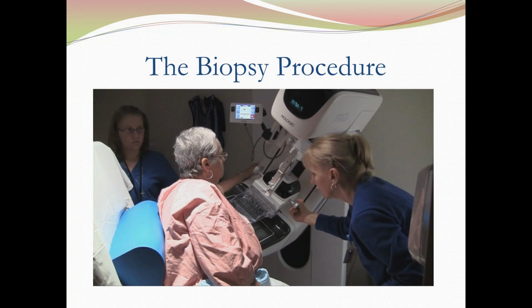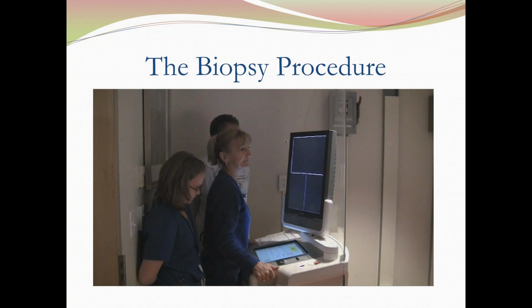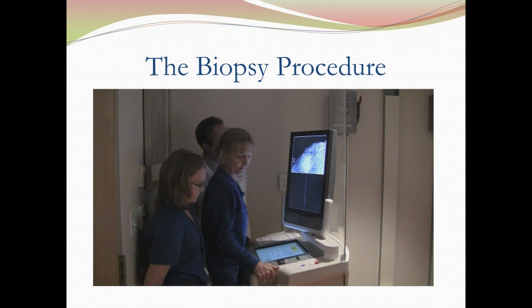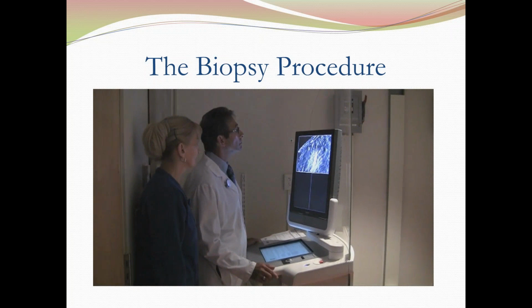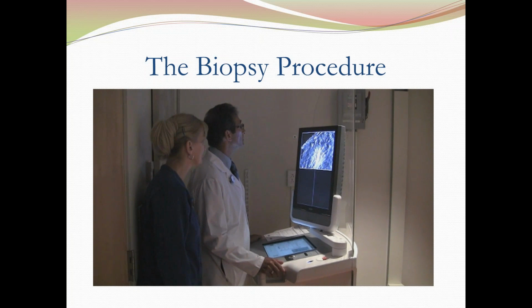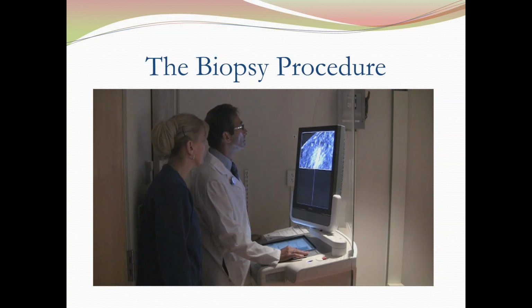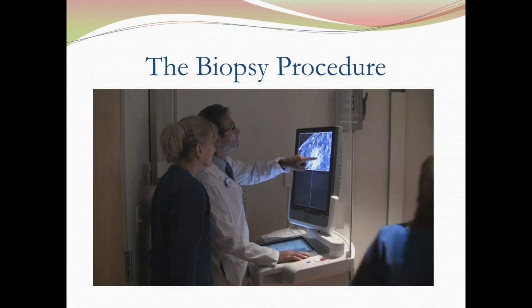Compression, just as you would have for a standard tomosynthesis or a prone biopsy. And here we are behind the console. This is those graphics I showed you. This is where we see it. Those are the acquisition of the projection images that we talked about. And here I am looking for the calcifications, and I'm scrolling through the tomosynthesis images at this point. And I'm looking, and I'm looking, and then the technologist, of course, finds them, and then I realize she's right.